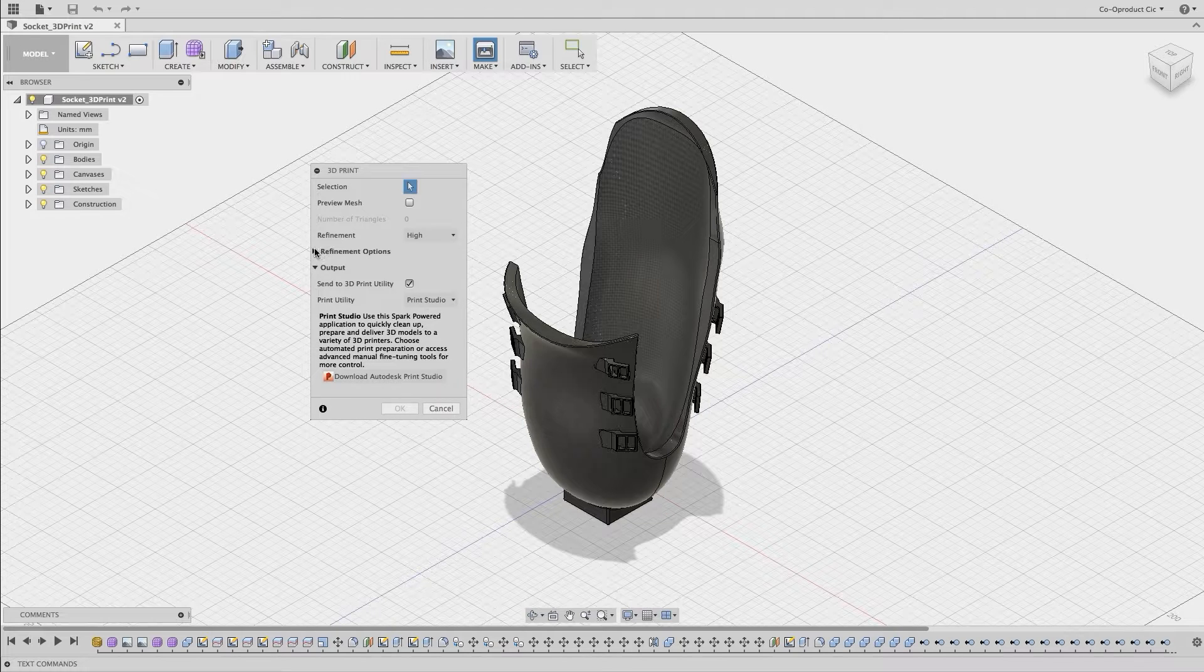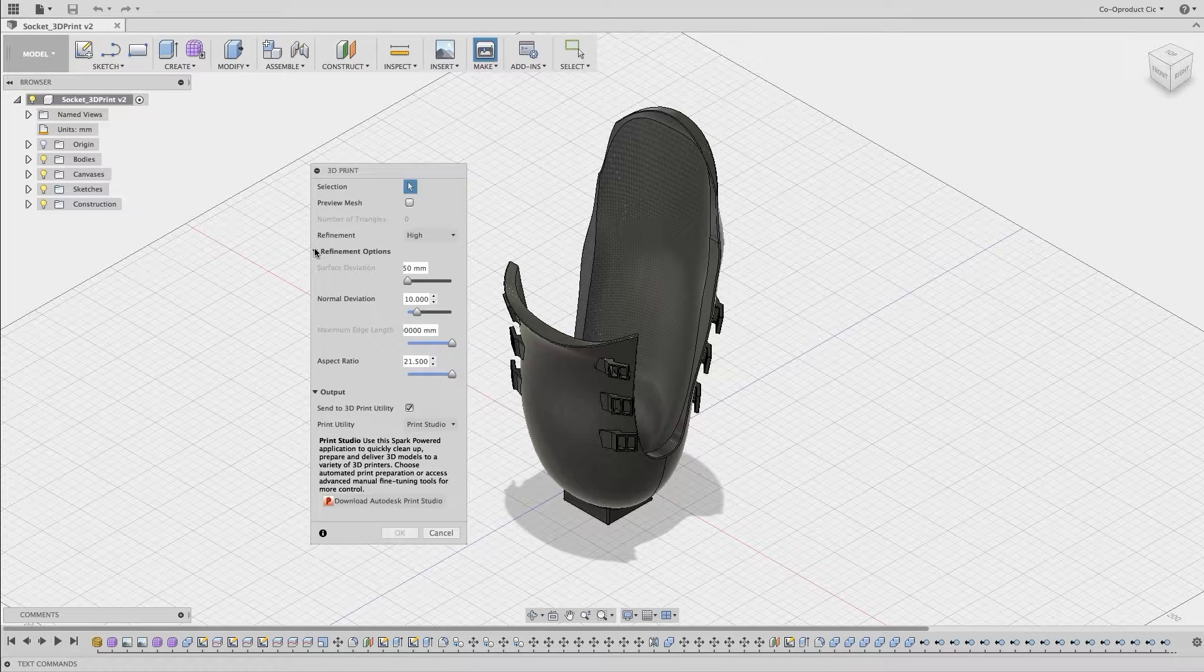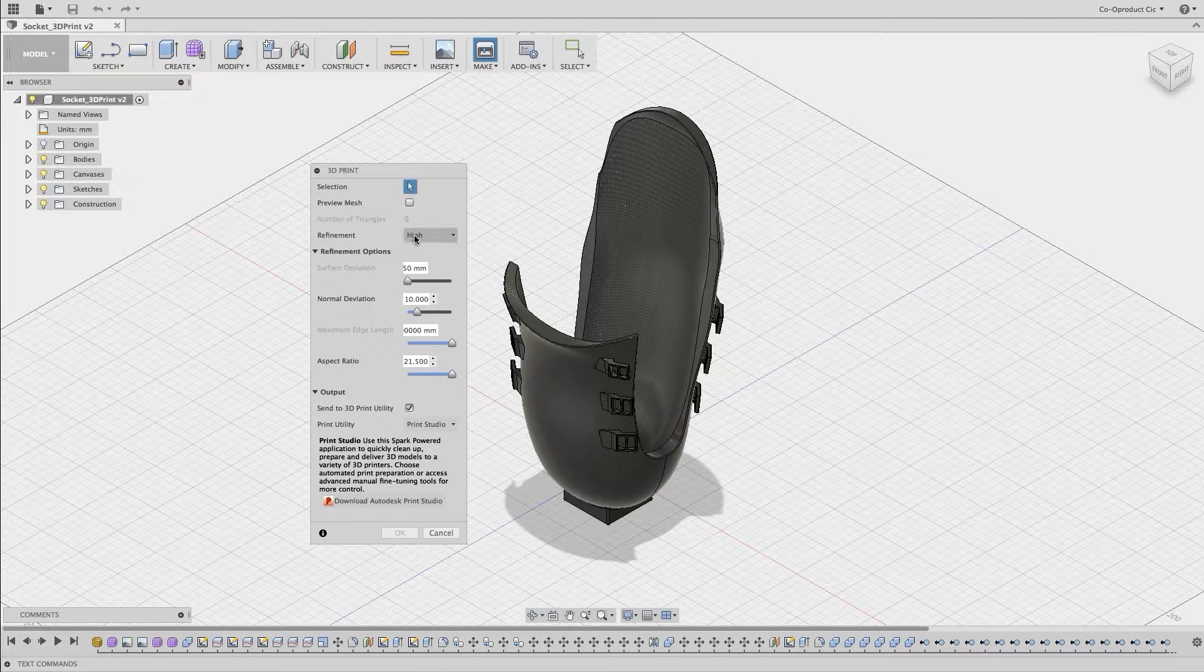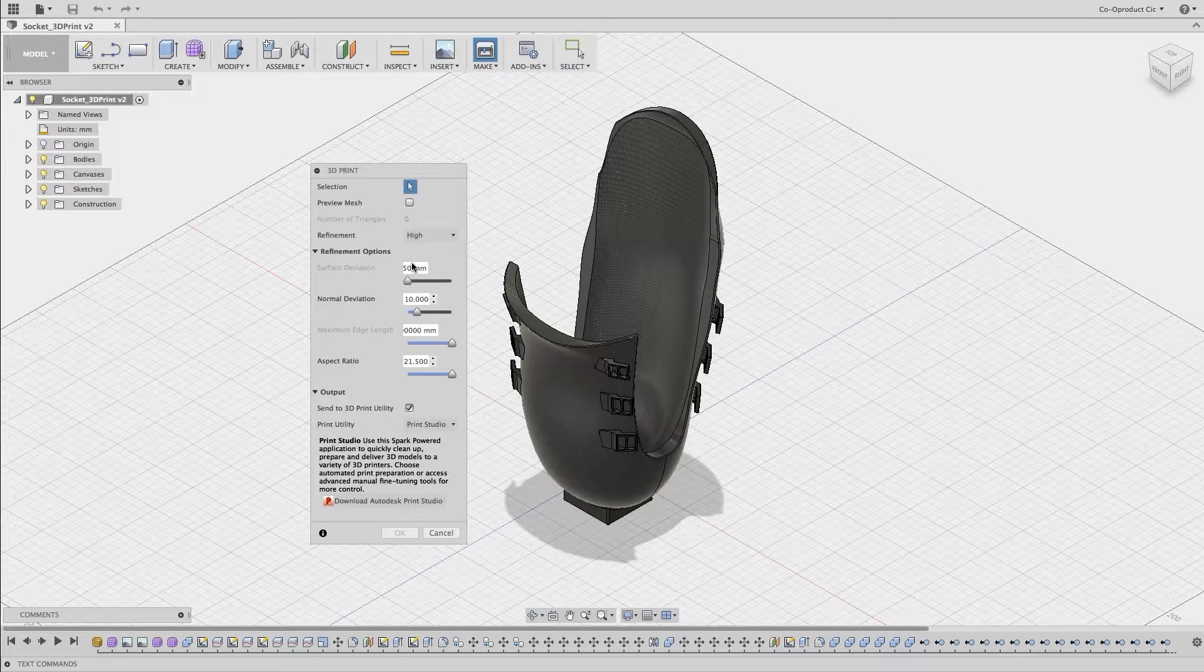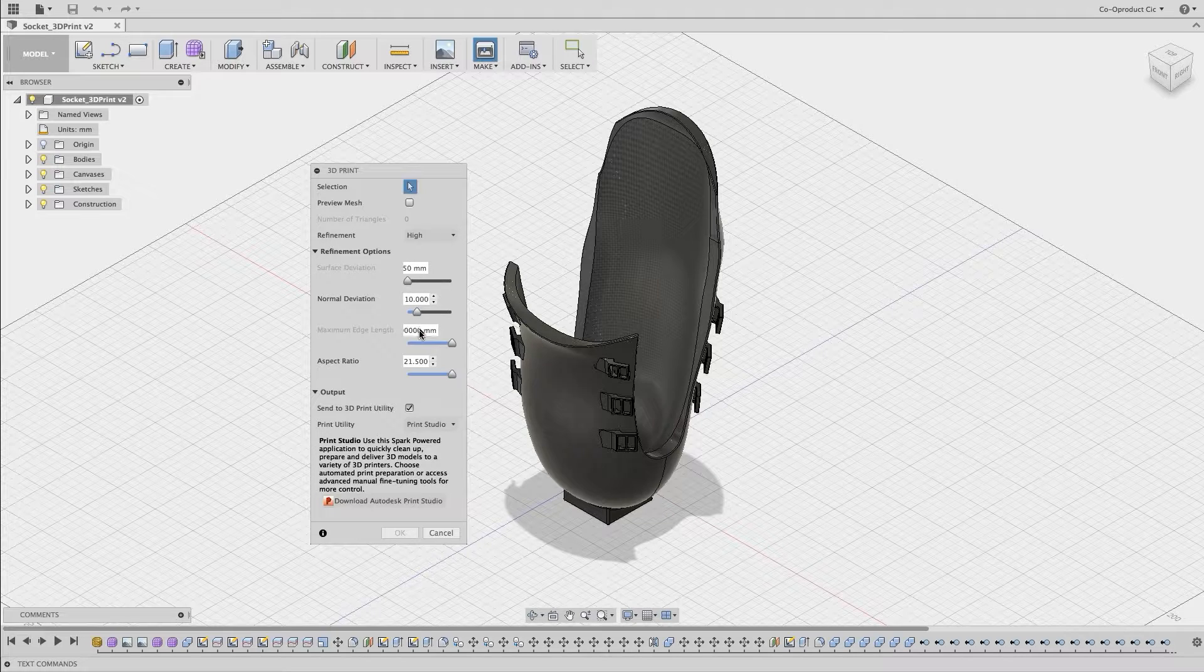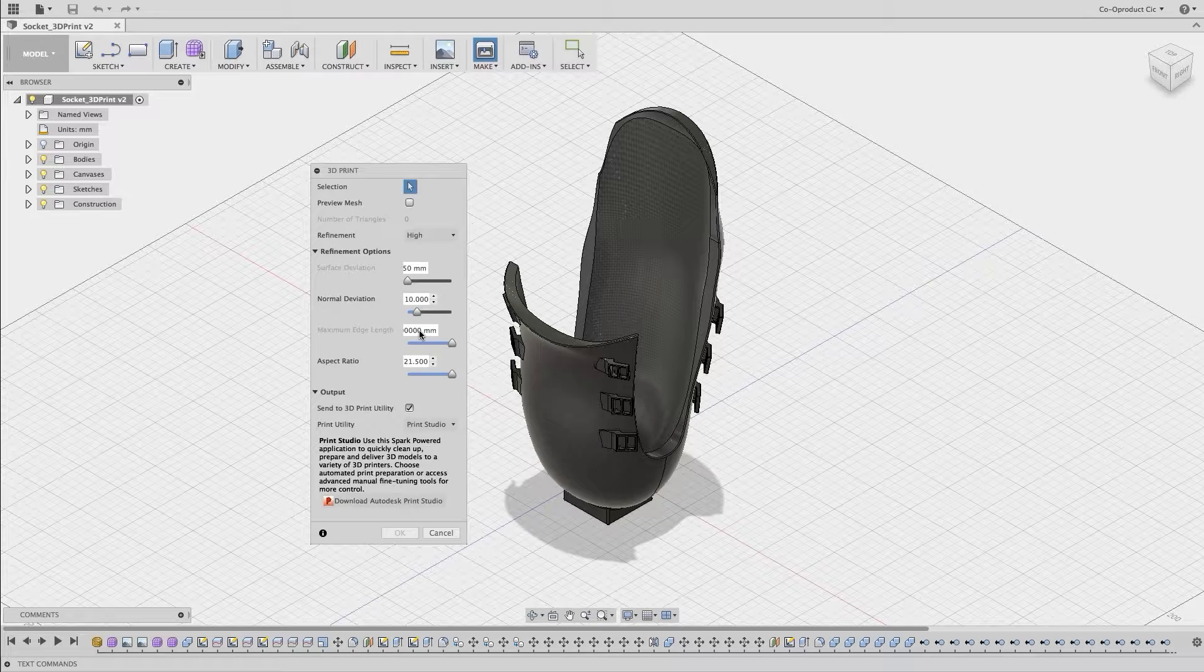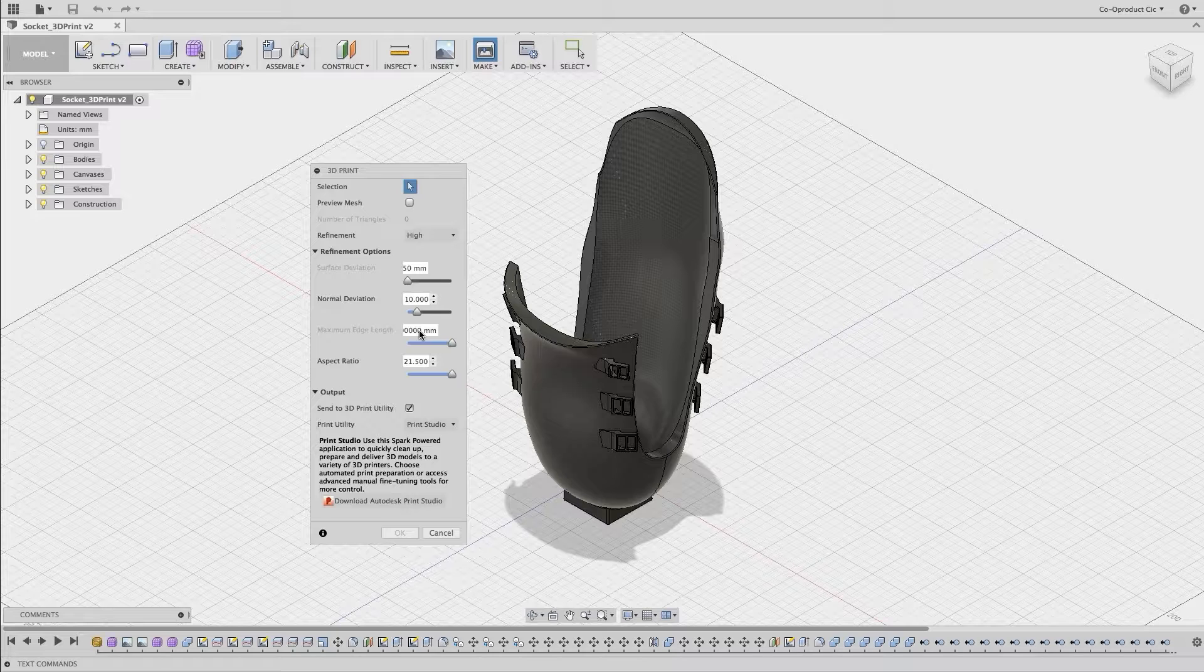We also have some refinement options, and we can change the normal deviation, the surface deviation, the maximum edge length, or the aspect ratio.